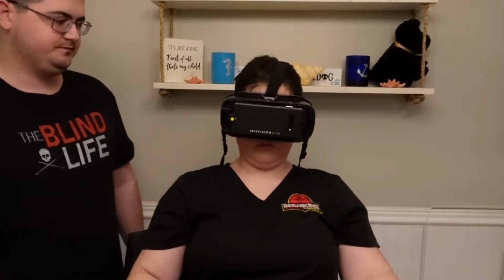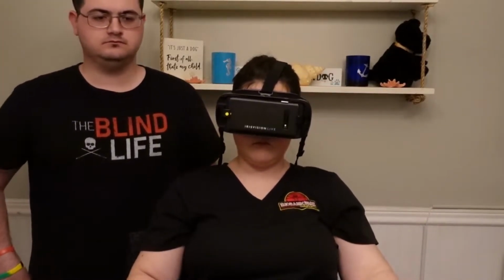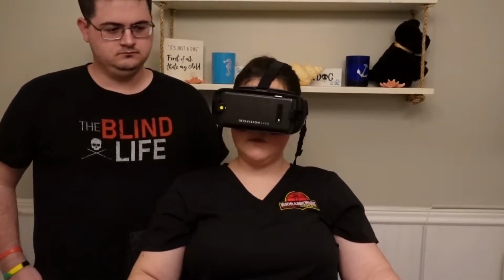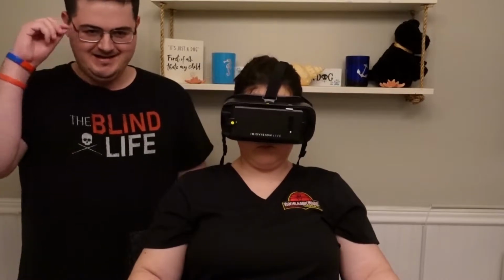There are 5 default modes with it. You've got focus, scene, television, reading, and reading inverted. I get to watch TV? You might. Depends.